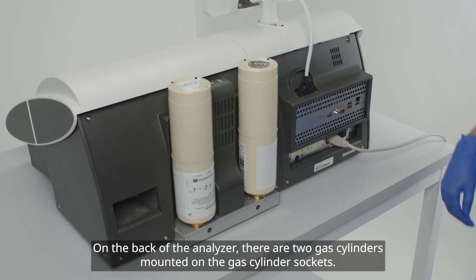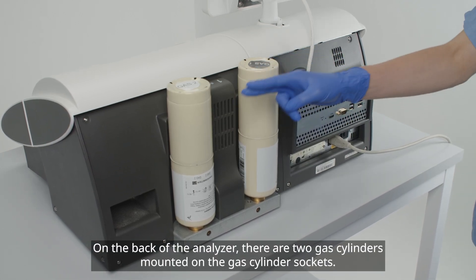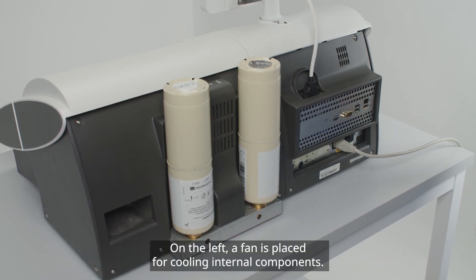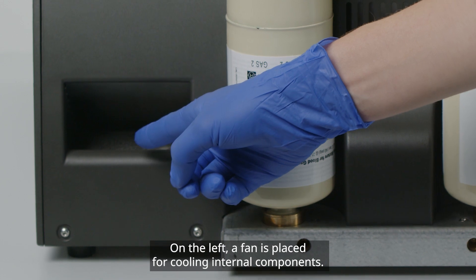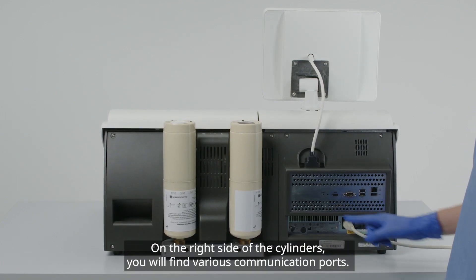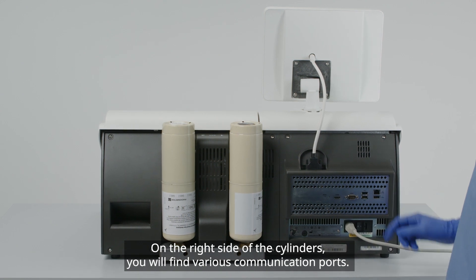On the back of the analyzer, there are two gas cylinders mounted on the gas cylinder sockets. On the left, a fan is placed for cooling internal components. On the right side of the cylinders, you will find various communication ports.